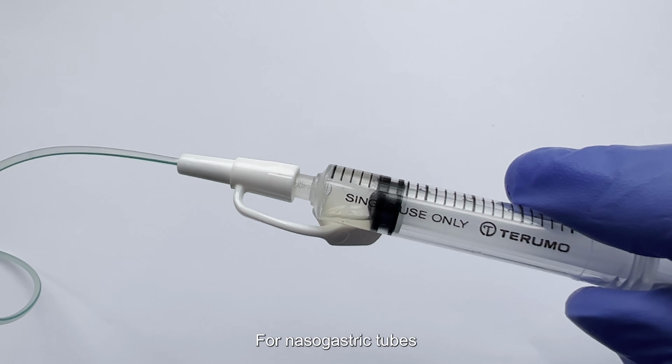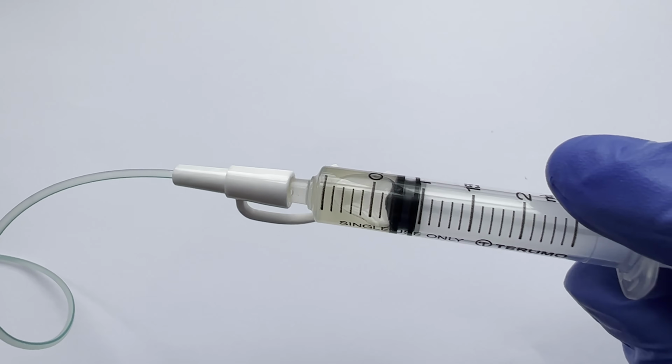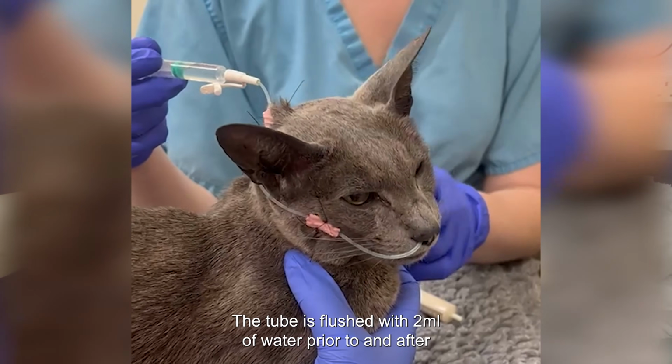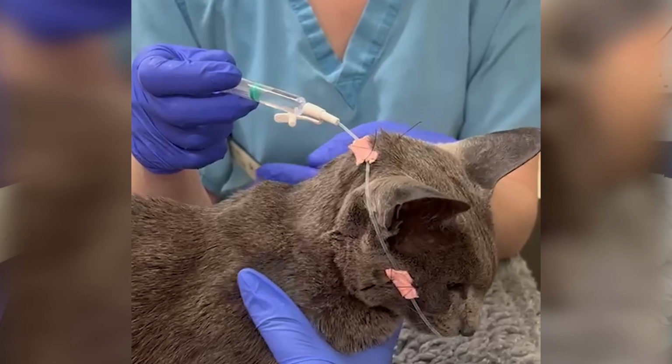For nasogastric tubes, some gastric fluid will be aspirated on suction of the tube. Tube placement should be checked prior to each feed. The tube is flushed with 2 ml of water prior to and after each feed to prevent obstruction.